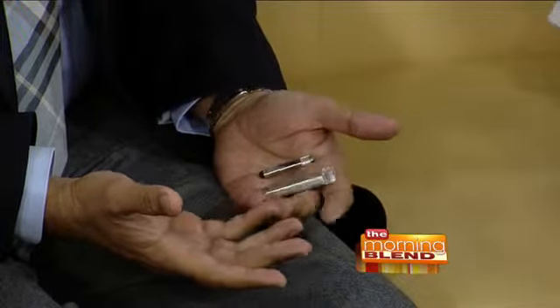An implantable loop recorder records a patient's heart rhythm continuously. It's for patients who have episodes where they may lose consciousness for no apparent cause, which is a very common problem. About 1 million patients in this country present to emergency rooms every year with loss of consciousness. If we implant this device, we help identify the cause. Very often the abnormal rhythm is dangerous, so we can find the problem and fix it before anything bad happens to the patient.